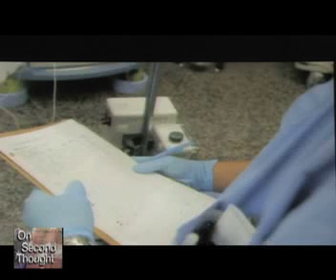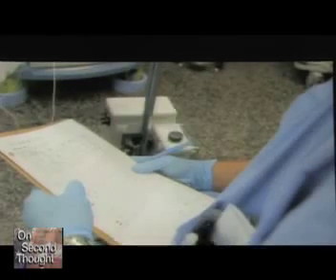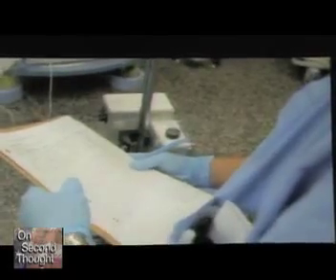So all of the drugs are being recorded. This record is not just some static document that gets put in a chart somewhere. It's part of the therapy. You can use it as you're providing the therapy, the anesthesia. You use it to see what happened 10 minutes ago. What was the blood pressure 10 minutes ago, so you can see if it's going up or going down. You use it to keep track of your drugs.